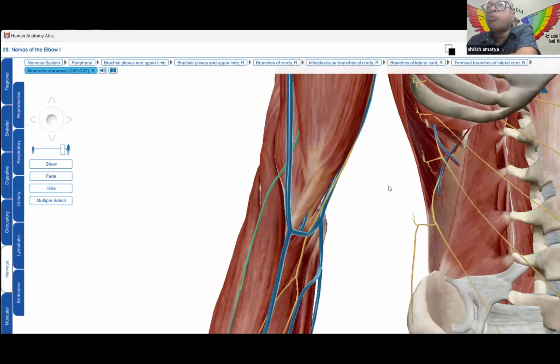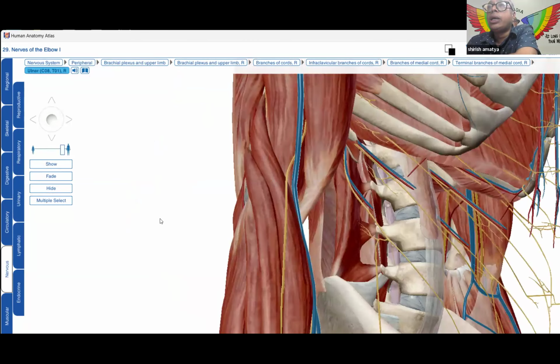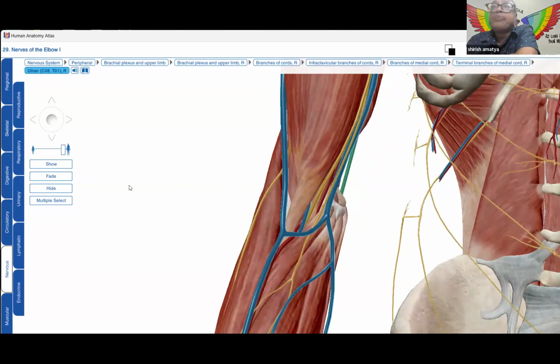And in the posterior aspect of the elbow, there is one nerve which is known as the ulnar nerve. So this is the ulnar nerve, which is in the posterior aspect of the elbow, which goes behind the medial epicondyle, and then it goes to the forearm. So these are the structures that we will be seeing in the sono-anatomy. If you want to see any structure revised, I can repeat any structure in the elbow joint. Any structure you want to repeat in this elbow joint?